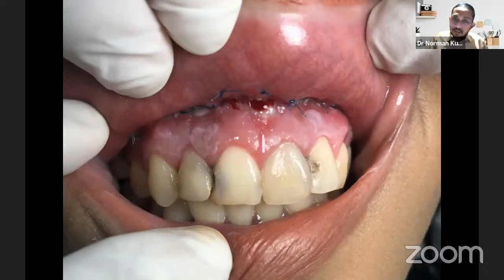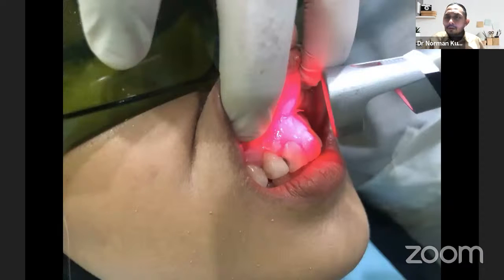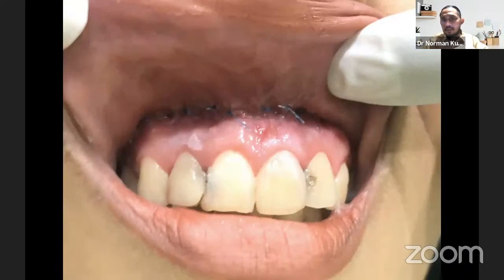As we can see, the soft tissue is already in regeneration, and as far as I'm concerned, it is a much faster regeneration than in a conventional therapy, because you get the benefit of surgery that is sterile with laser, and you promote and speed up the healing regeneration with the low level laser therapy. I also do the laser therapy in the second visit, and in the baseline and the first visit I do a laser therapy as well.